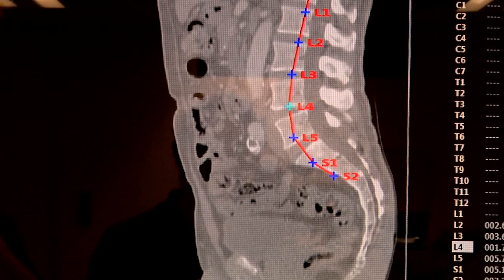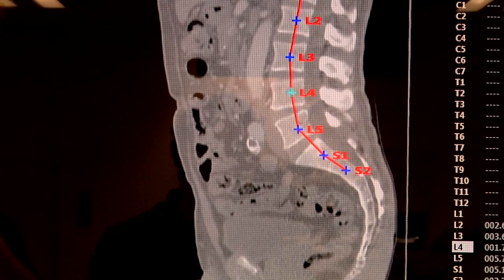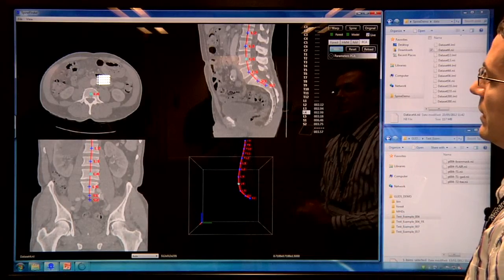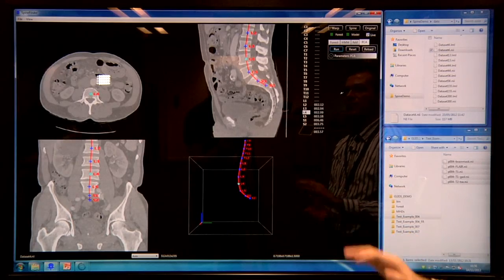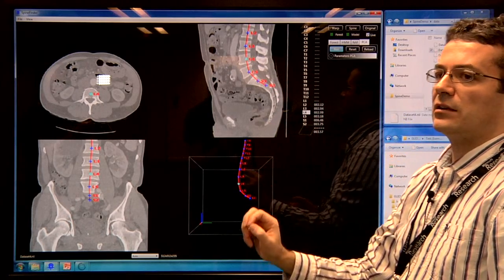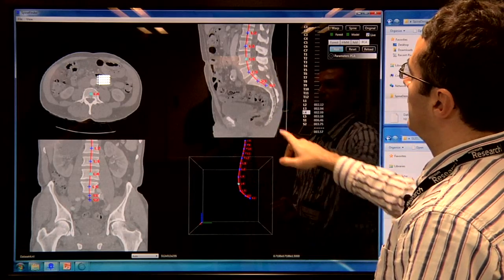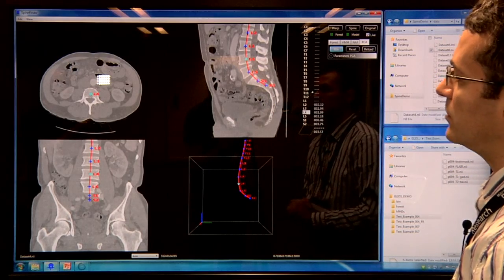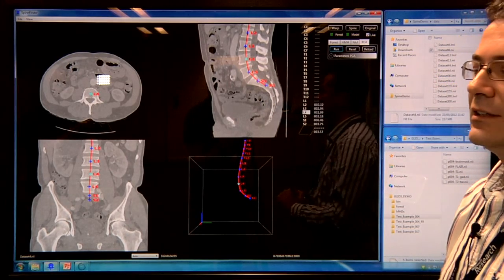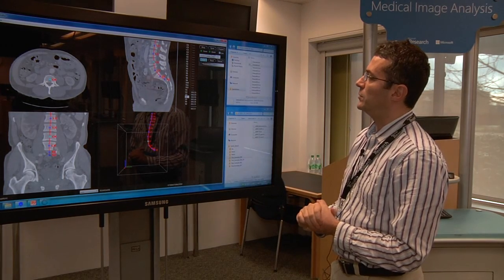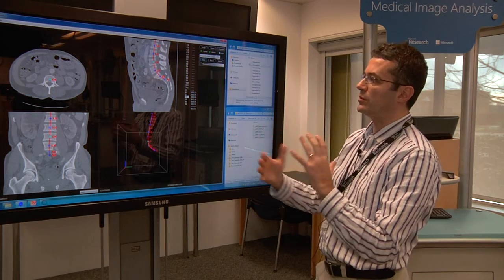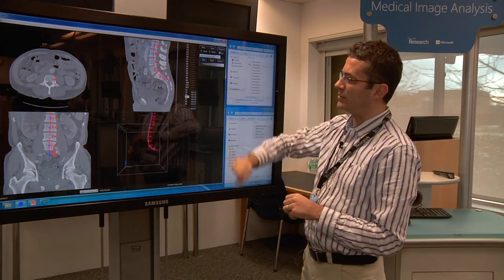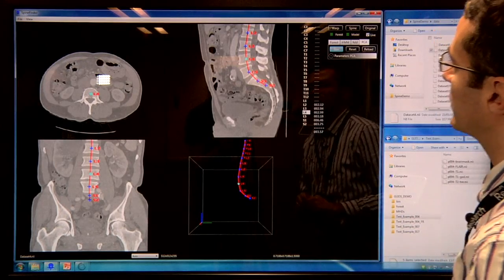I launch a second round of refinement and you can see the position of the spine and the individual vertebrae being refined on the go. Now it's done. After a few seconds, you already have a very good idea of where the spine is, and not only that — you have the exact name for each of the vertebrae. You might think any trained radiologist can do this very quickly, but it turns out it is a little time consuming for them too. They have to change between different views and sometimes resort to actual counting from the head downward to figure out which vertebrae they're looking at.